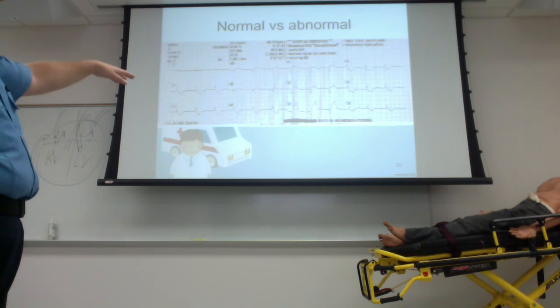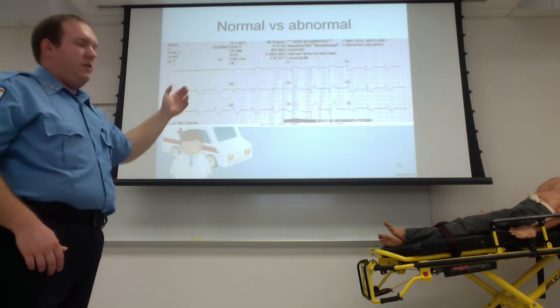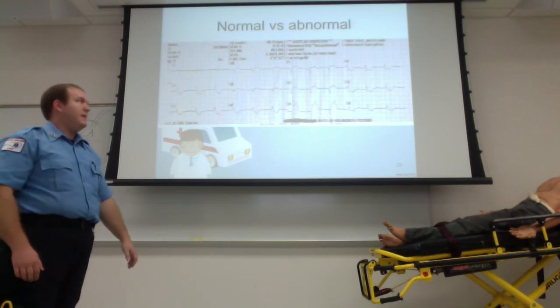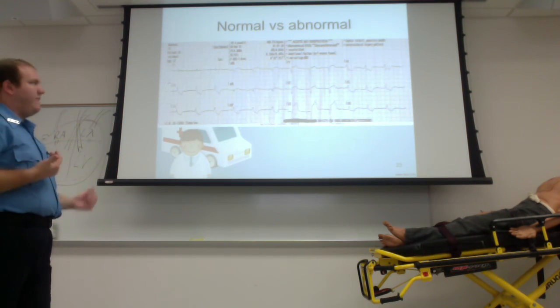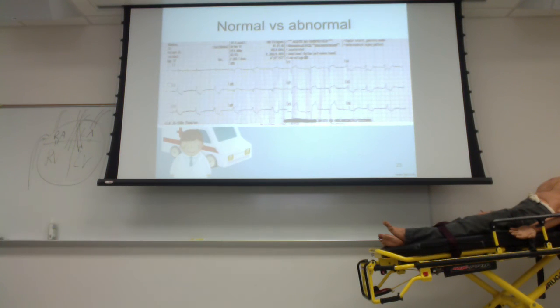Well, if you go back there and read it, like we talked about, the septal leads are where your elevation is at. That is where you say, oh look, there's where my heart attack is occurring. Cool, hey, paramedic crew, doctor, here's what we see, we have elevation of these leads. We'll see you guys when you get here. Just gives them an extra heads up, so they know what they're getting into.